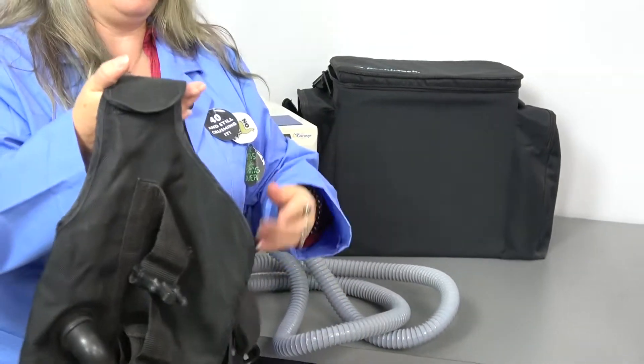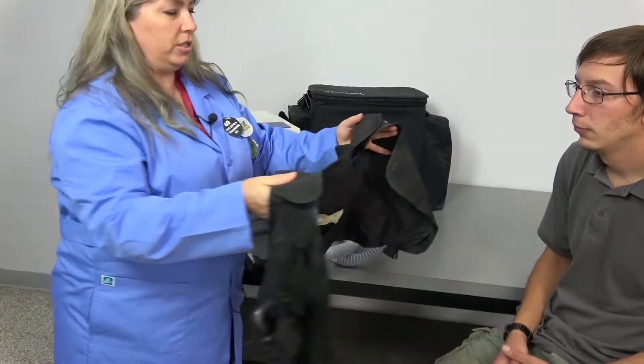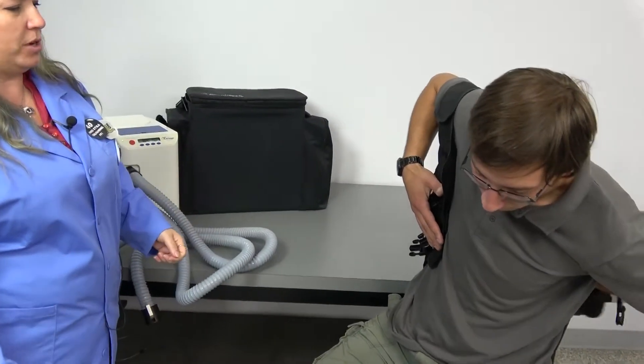This vest is made of lightweight nylon. It adjusts from 16 to 60 inches on chest size. Our technician Bart is going to give us a hand with a demonstration today.